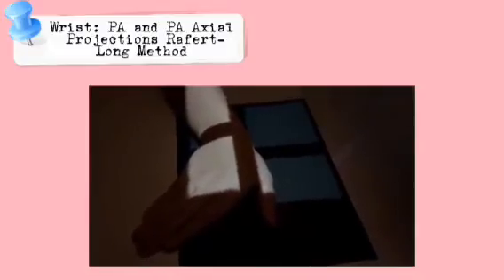Central ray, perpendicular and with multiple cephalad angles. With the hand and wrist in the same position for each projection, 4 separate exposures are made at 0, 10, 20, and 30 degrees cephalad. The central ray should directly enter the scaphoid bone. Collimation should be close to improve image quality.